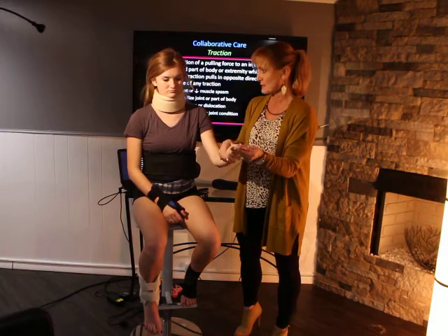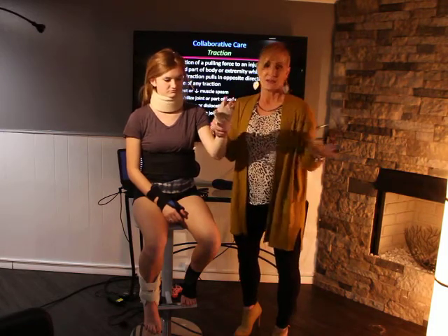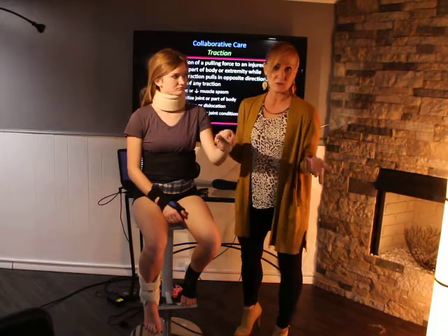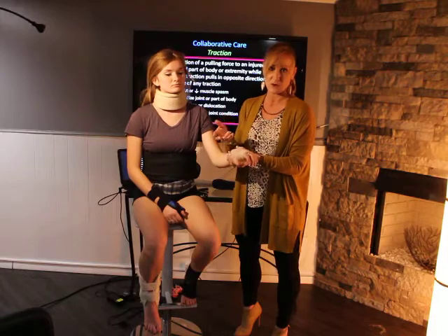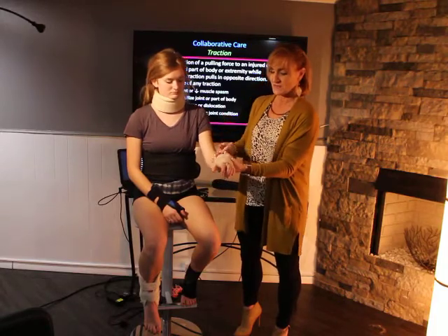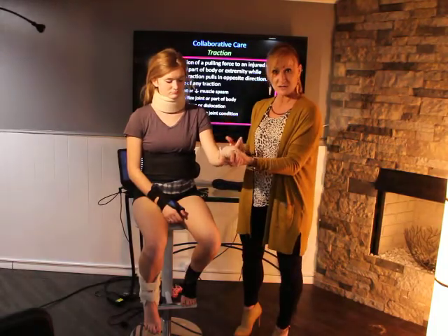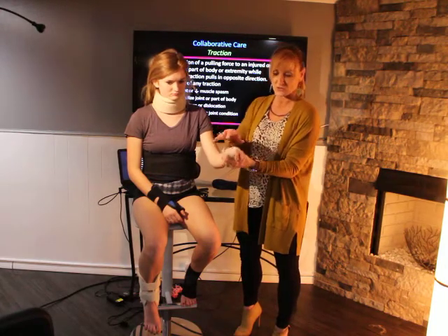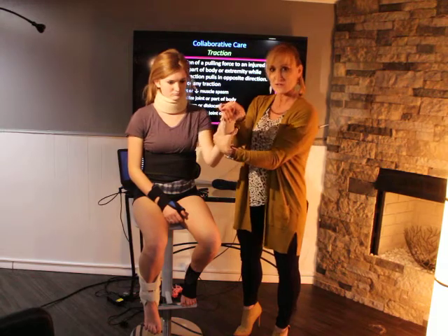Are you experiencing any pain? Is that uncomfortable? And then you're going to send them home like that. You probably want to teach them or whoever they're with how to wrap that. You know, people can do this at home, but they do need to know, they need to feel how snug it should be, because patients who put these on at home tend to make them either too loose or too tight. You're going to want to teach them how to watch those fingers.